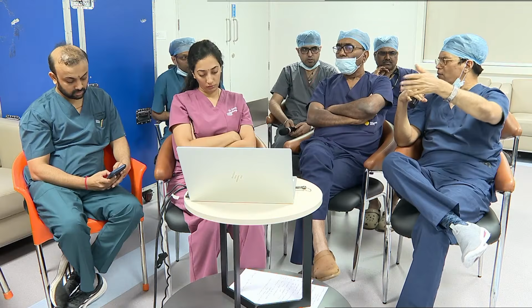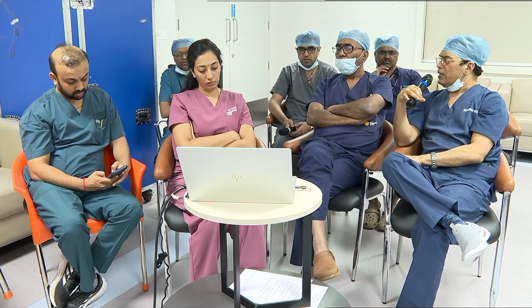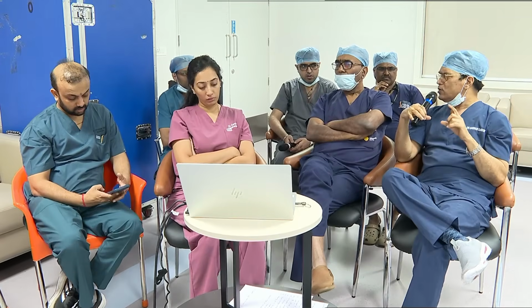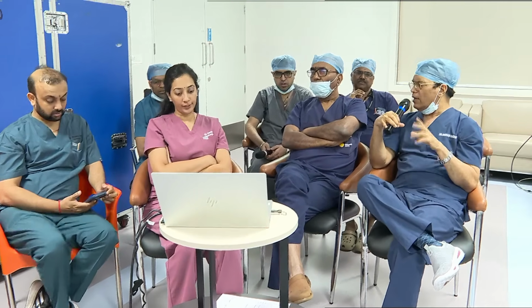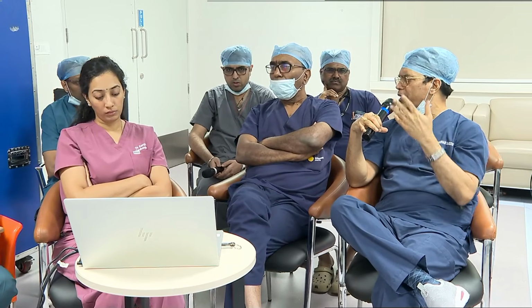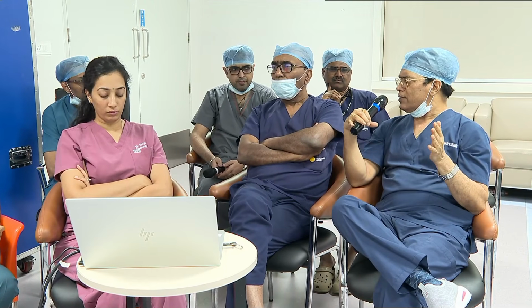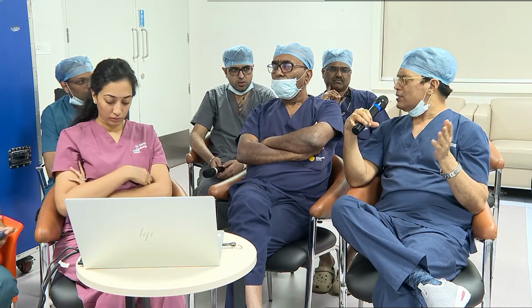That is like 120 pulses, and each time we are giving 10 pulses. There you have equal size to the coronary artery. IVL always uses equal size, but there is no such thing for peripheral. In peripheral you can use 6, 7, 5 and modify, but in the descending aorta, the size is much bigger. That big size is not there.